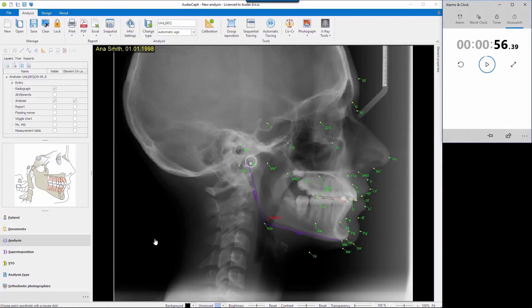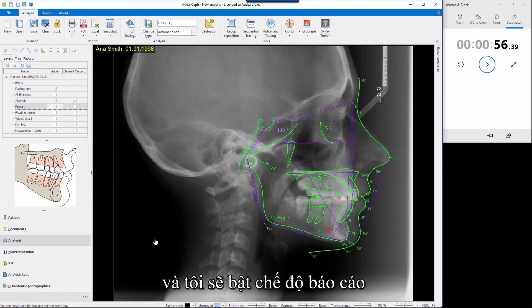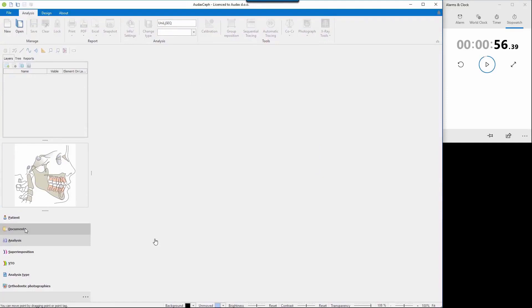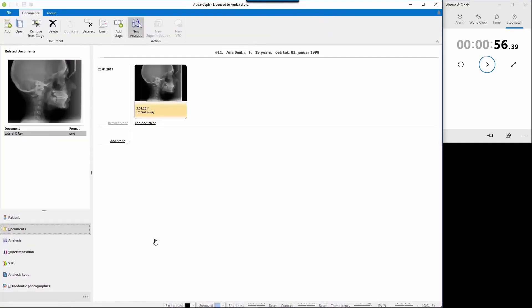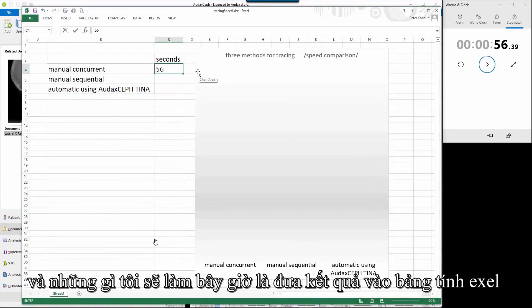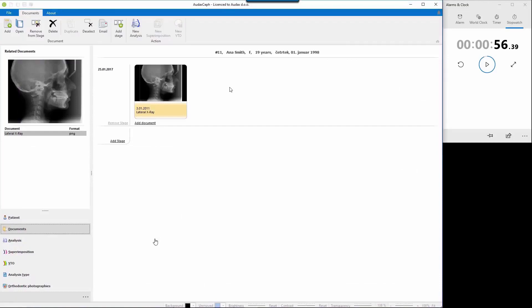56 seconds to do this tracing — I'll remember that. I can switch on the report layer to check whether the silhouettes are okay, and then I'll put the result into the spreadsheet. It is 56. Now let's go to the second way of tracing.